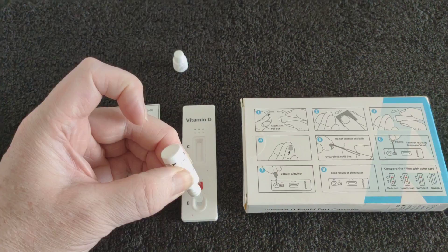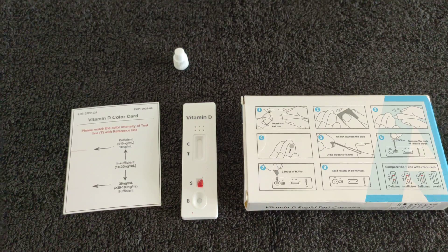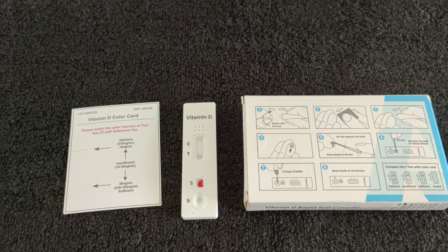Two drops of buffer — one, two. Take the result at around ten minutes. I suppose it's a green, amber, red result. You get deficient, you get insufficient, and you get sufficient.